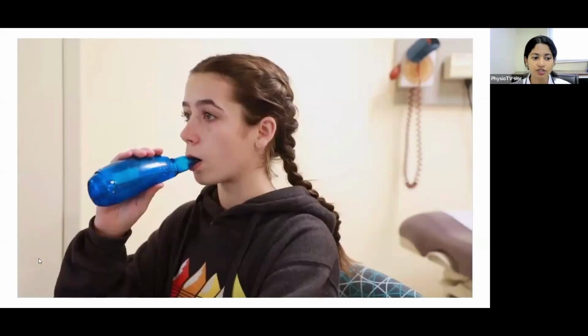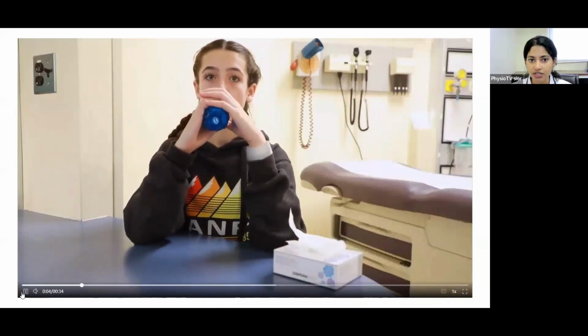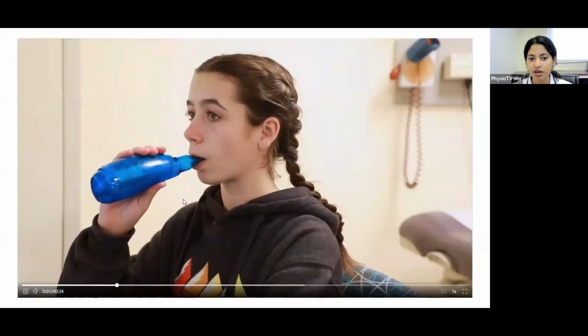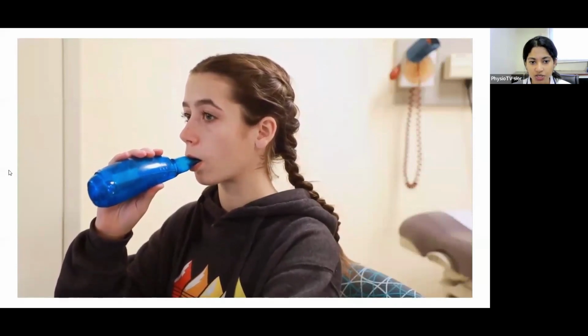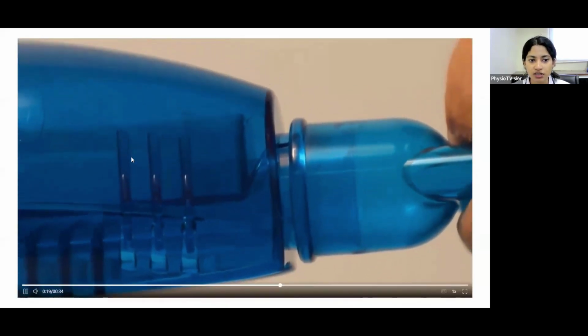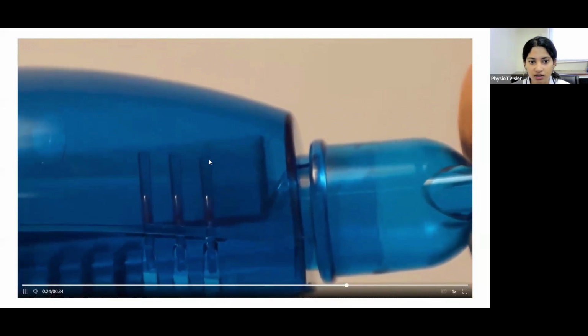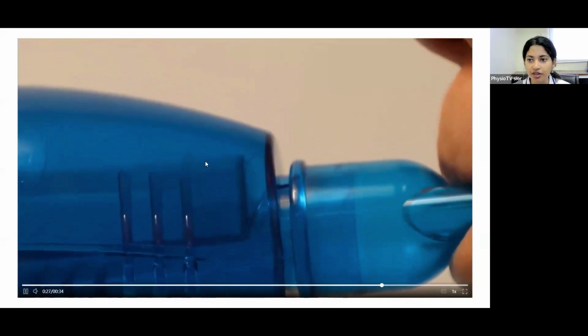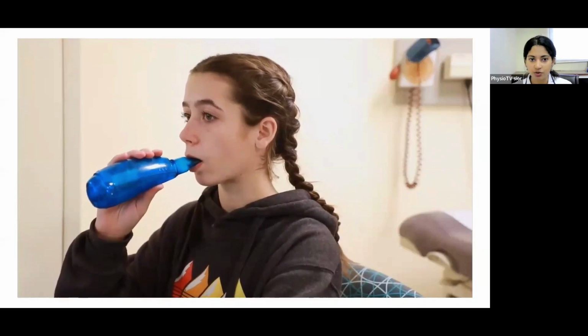Here is another video which we'll look at, of a subject using Acapella. It is again a pipe-like device with a mouthpiece. The subject will breathe in from around the device or through the nose and expire into the device. There is a magnetic component, as we saw, which will be attracting and moving, which will cause the oscillation. As you can see, this is the object which will be offering the intermittent interruptions to the expiratory flow.